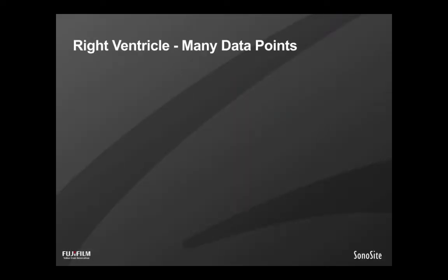So the right ventricle, unlike in many ways the left ventricle, has a laundry list of data points you can collect with which to inform your understanding of right ventricular function. These things include, of course, a global assessment of the size of the right ventricle, the IVC, and a number of the advanced topics that are on the table here.